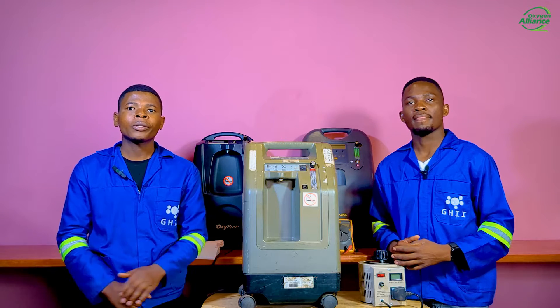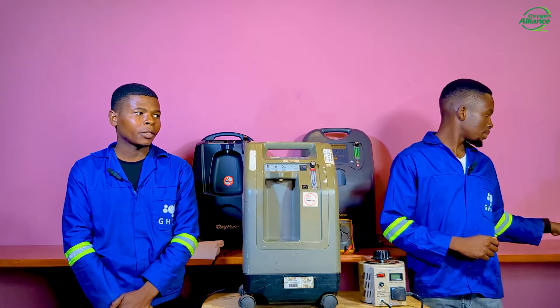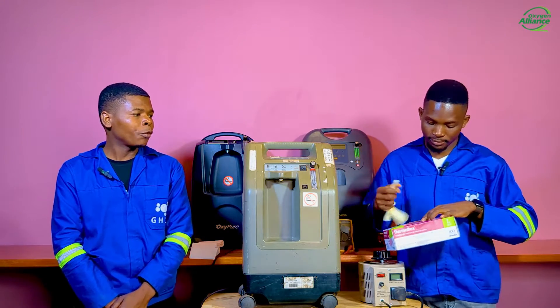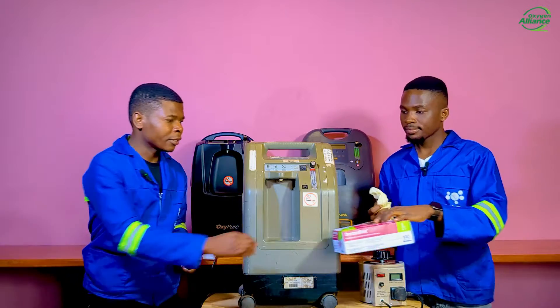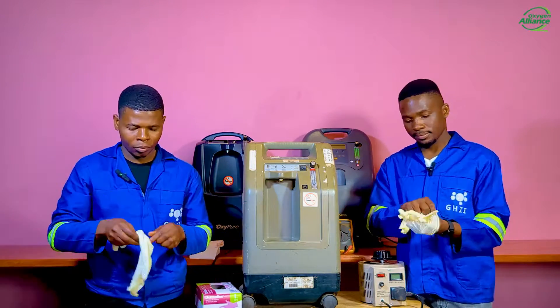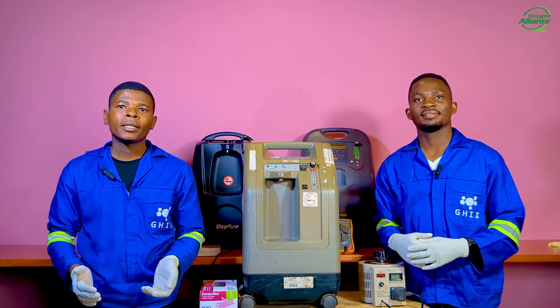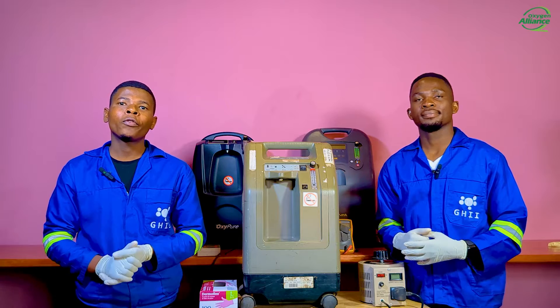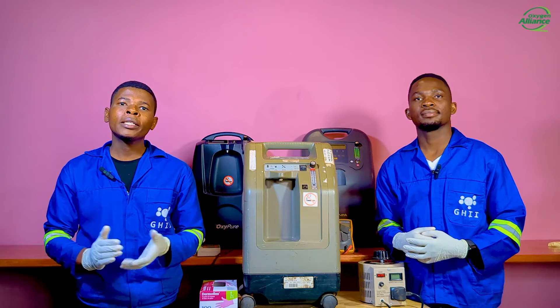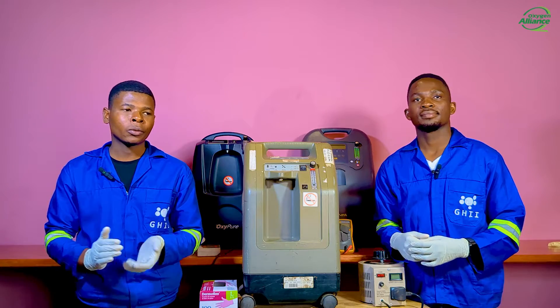Before touching the oxygen concentrator, take steps to protect yourself from germs, so we will put on gloves. This will help prevent potential exposure to microorganisms. Next, ensure that the machine is properly disinfected before performing any maintenance work. It is recommended to use alcohol-based disinfection to wipe down the exterior surface of the oxygen concentrator.